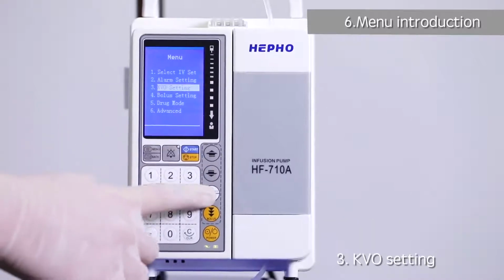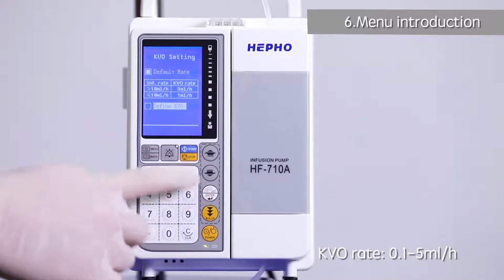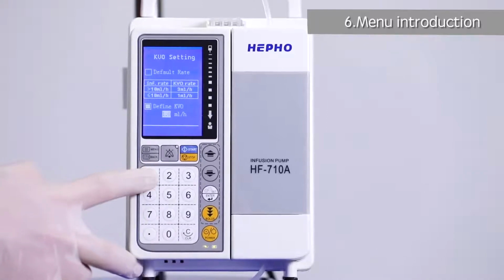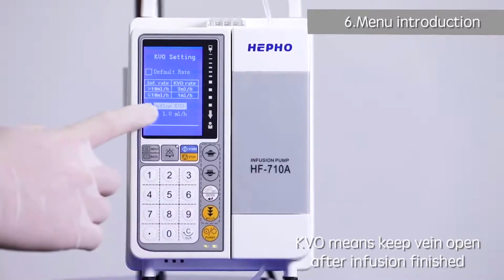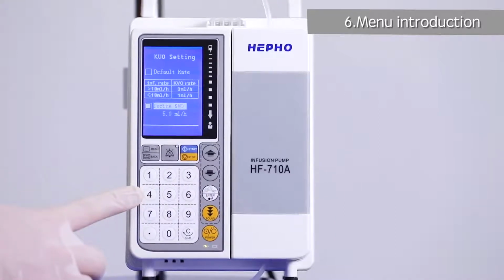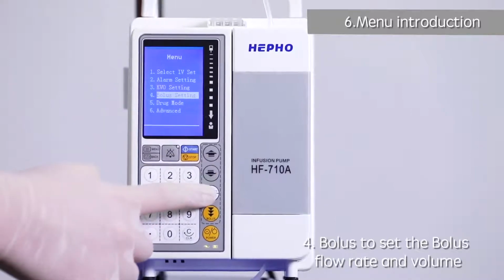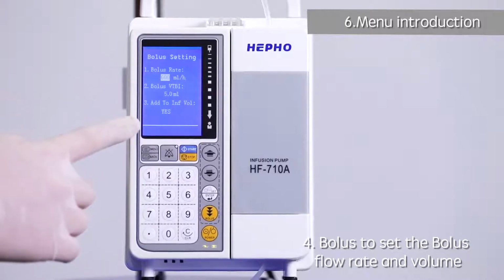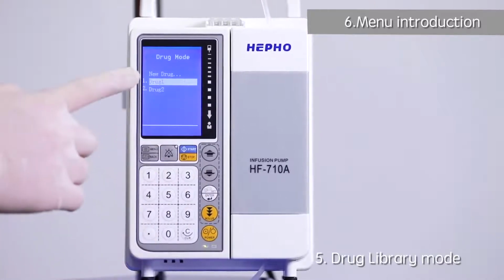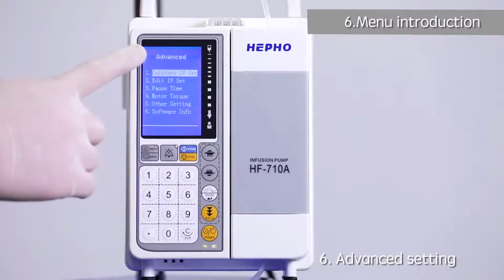3. KVO setting. Defaulted KVO rate and defined KVO optional. KVO rate 0.1 to 5 ml per hour. KVO means keep vein open after infusion finished. 4. Bolus to set the bolus flow rate and volume. 5. Drug library mode. To add, edit, set the drug parameter. 6. Advanced setting.